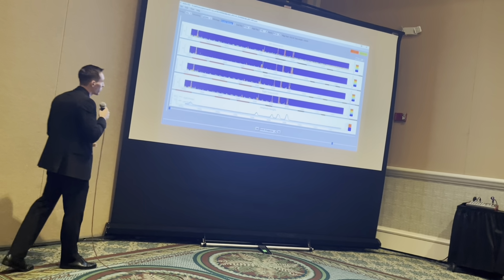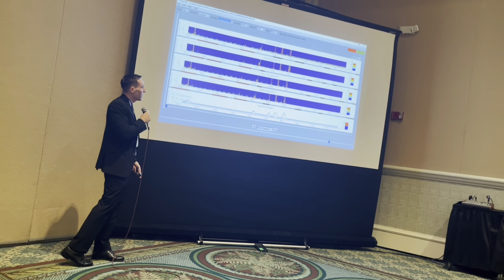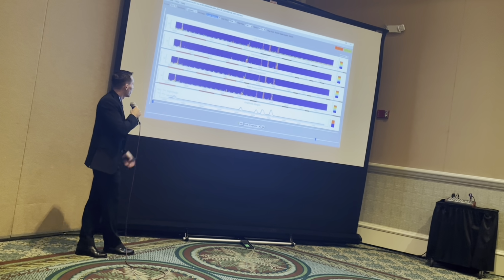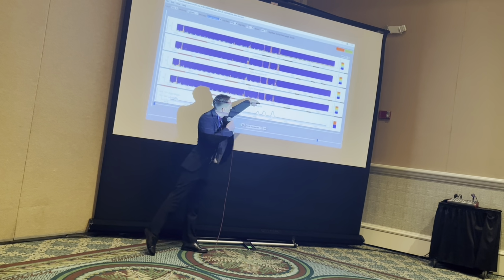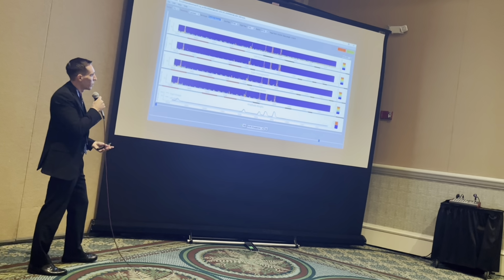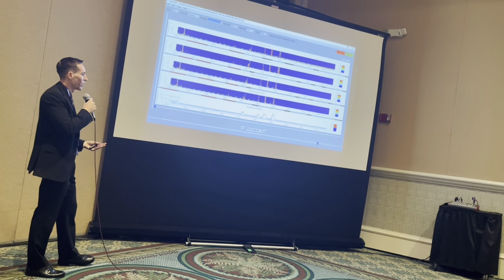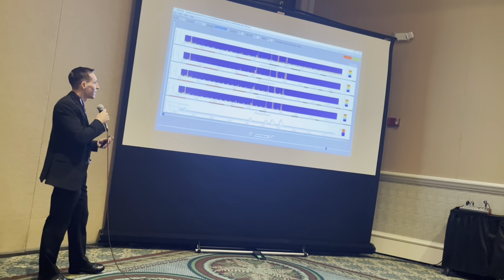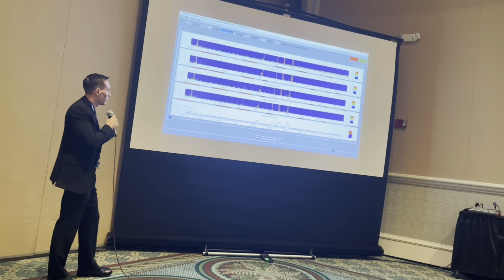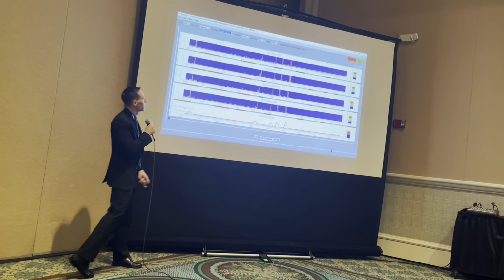Now, the last pattern I want to show you guys is where it all ends. This is a completely suppressed EEG. You're going to see just all blue. The reason for these little specks and big increases in amplitude is because those are points in the record where the nurse is moving the patient and the electrodes are essentially going crazy. I'm sure you guys have seen that in your ICU patients. So a completely suppressed, brain death pattern is going to look all blue, and the amplitude is essentially 0.